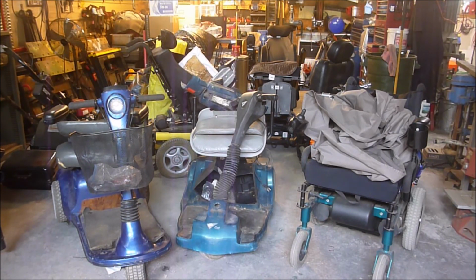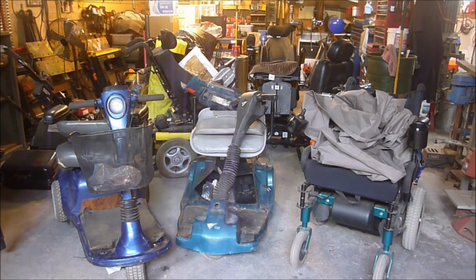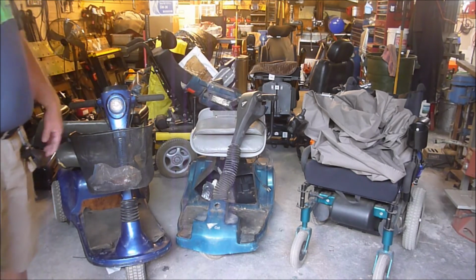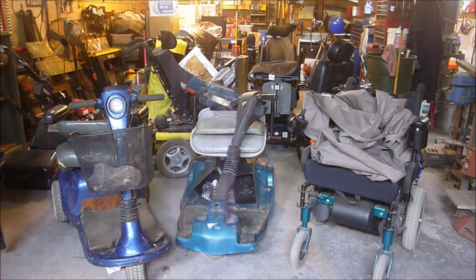Try and waterproof it as much as you can, because these things are not actually supposed to go out in the rain. I do think that these ones, yet again, do all right. As far as these ones are concerned, I get a little bit worried about water getting down into the electronics up here and stuff, but I've so far never had those ones in super pouring down rain, and light rain they seem to do okay. But once again, that's up to you to figure out.